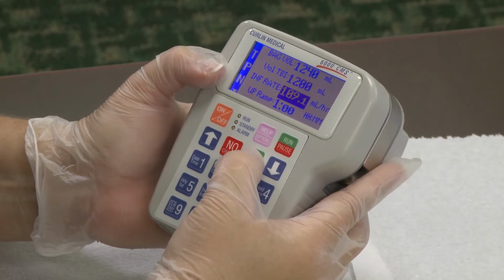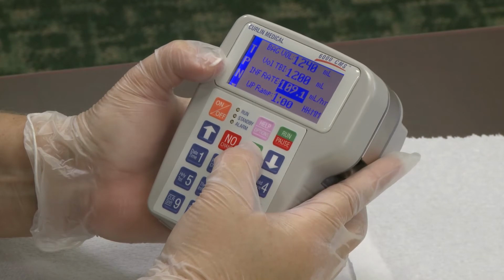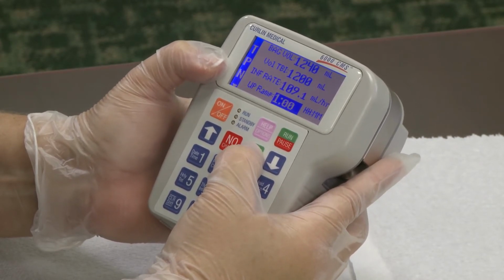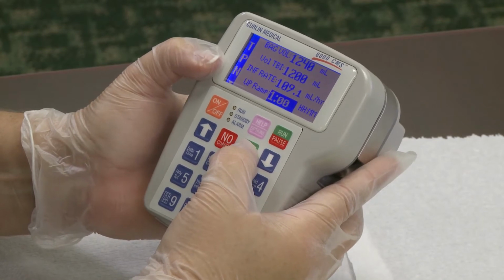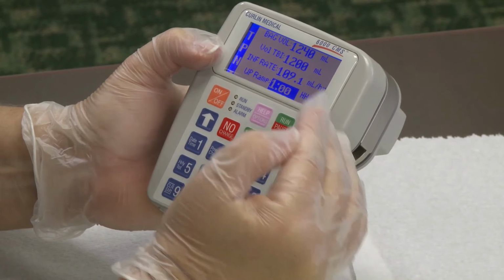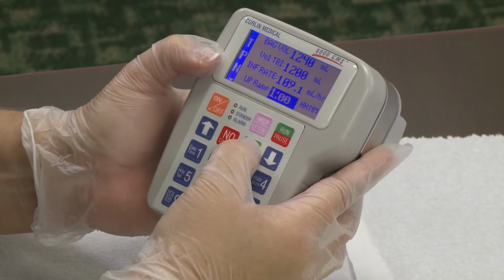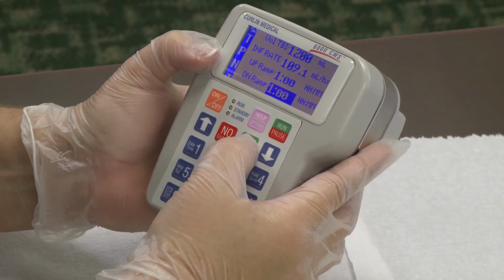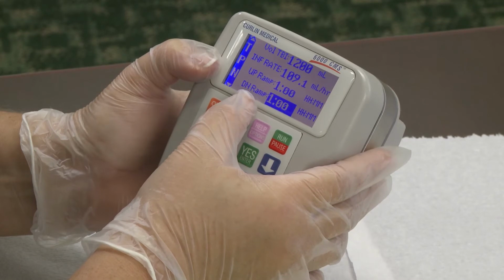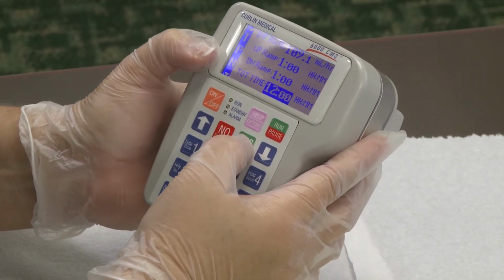INF rate is infusion rate. This is going to run at 109.1 mLs per hour. It's going to ramp up over 1 hour, meaning the first hour this is on, it starts off very slowly, and over 1 hour it gets up to that 109.1. So I say yes or enter. And ramp, on ramp, up ramp, and this is off ramp, is 1 hour up and 1 hour down. At the end it'll do the same thing and ramp down.